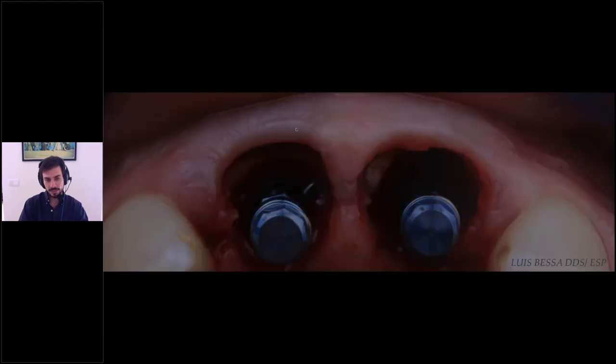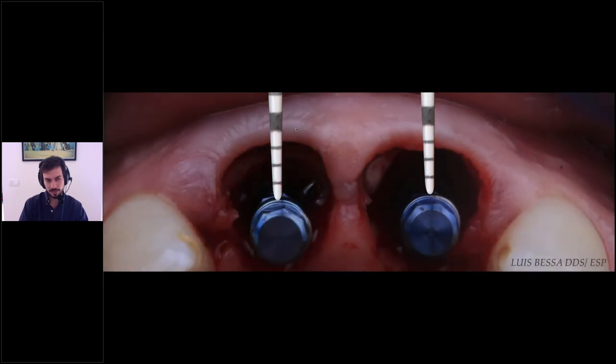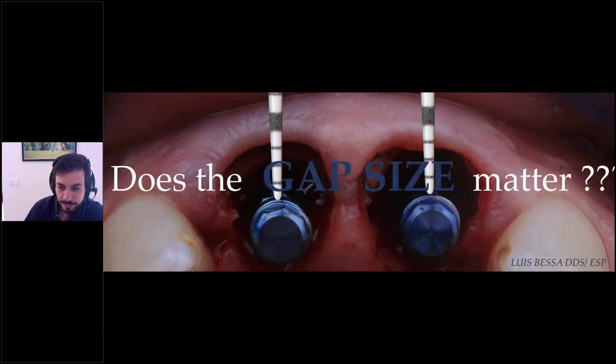Yes, the size of the gap matters for the emergence profile, and it matters to have some room and some space for our prosthetic restoration.